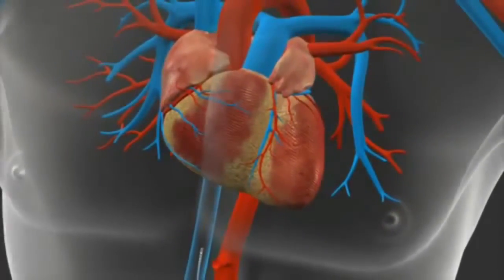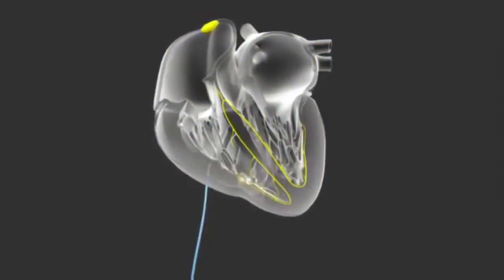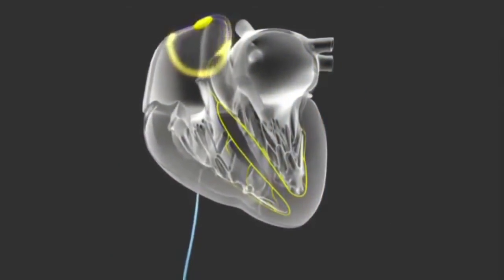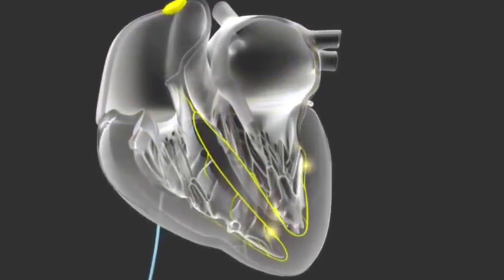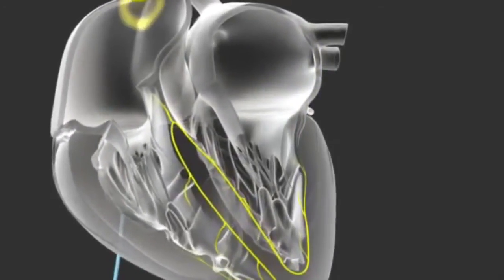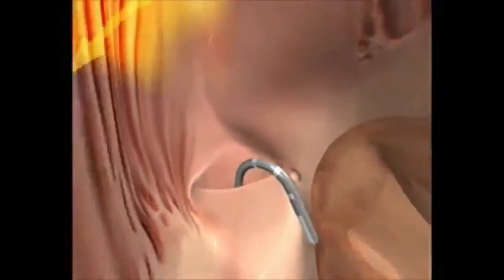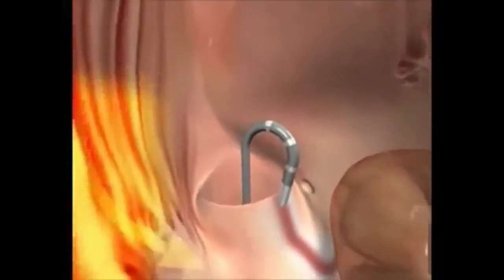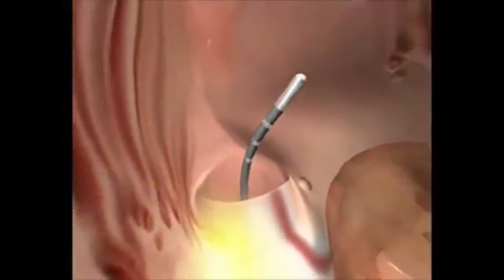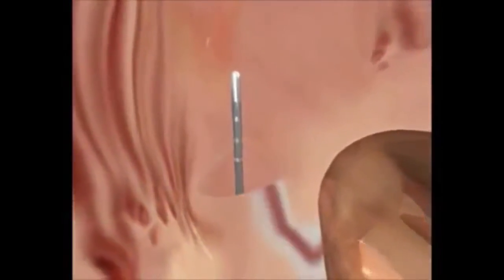These catheters can stimulate or pace the heart and also record electrical activity. Pacing the heart usually results in triggering of the rhythm abnormality. By analyzing electrical recordings within the heart, we can precisely determine the location of the electrical problem. A catheter which is positioned at the site of the electrical abnormality delivers radiofrequency energy, thereby modifying the heart tissue and eliminating the abnormal rhythm.